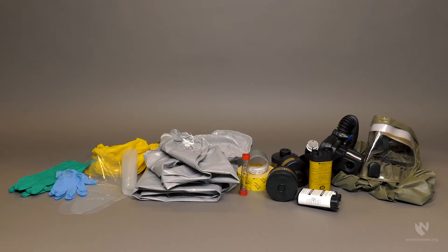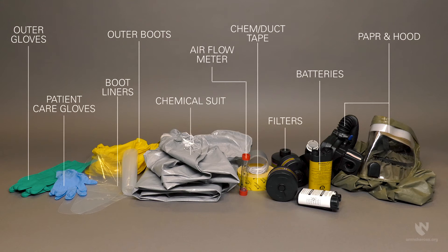You will need the following equipment: a PAPR and hood, batteries, filters, chem tape or duct tape, an airflow meter, a chemical suit, outer boots, inner boot liners, patient care gloves, and outer gloves. You should also have a chair available that can be used while donning the suit.